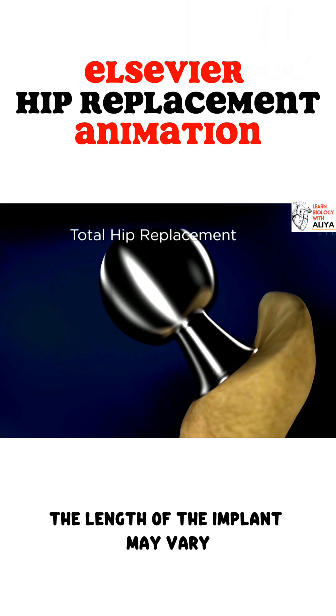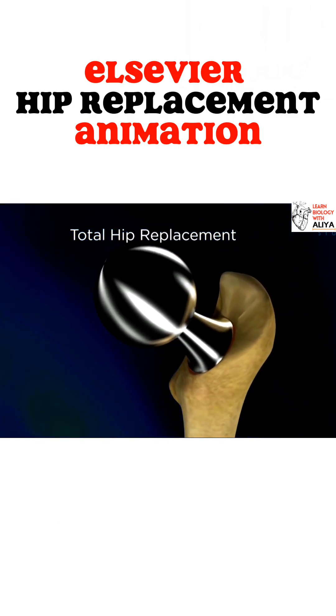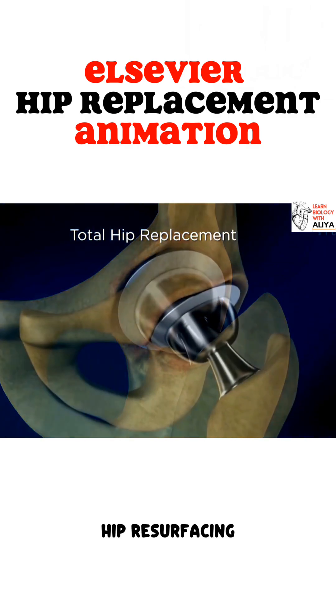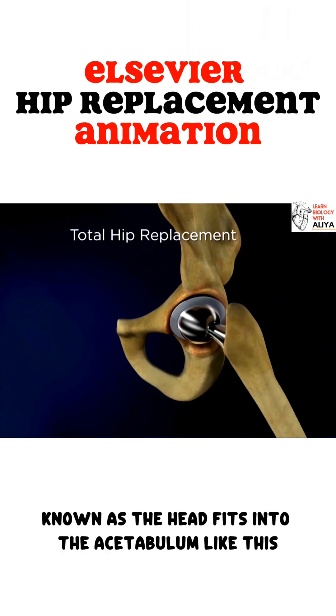The length of the implant may vary depending on the bone quality. If the bone is very strong, we may use a short stem. If we use a short stem, this hip replacement operation is called hip resurfacing. The ball on this metal stem, known as the head, fits into the acetabulum like this.